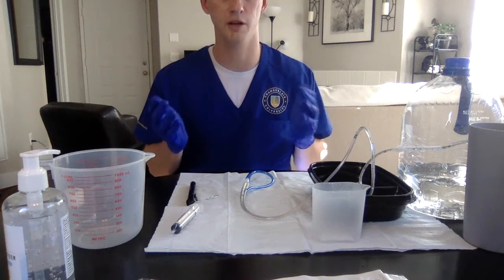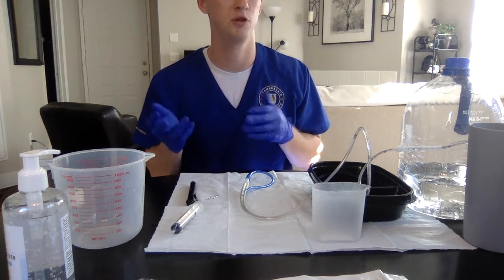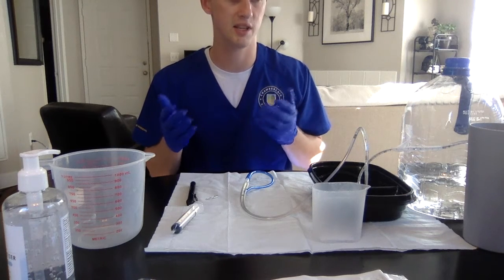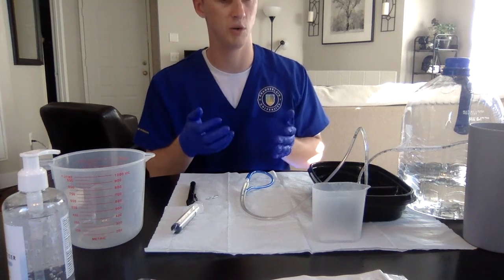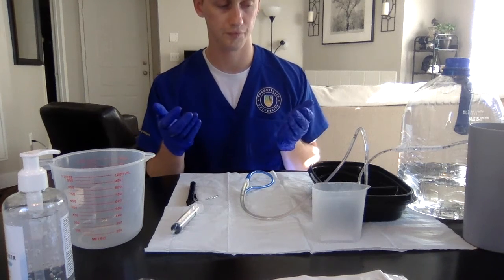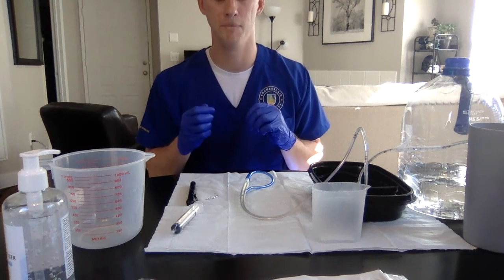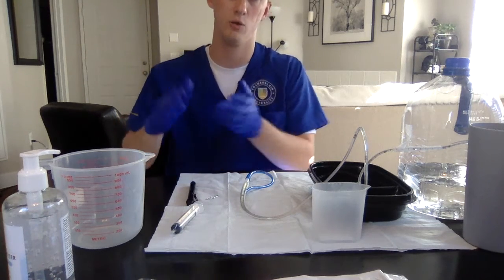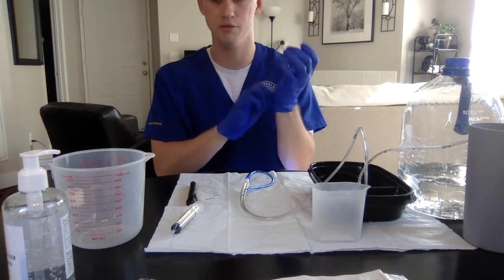So then we'll say a few days later, the doctor asked for us to remove the NG tube. We would enter the patient's room, introduce ourselves, ask for the 2 patient identifiers, so ask for their name and date of birth, assess if they have any allergies or if they are in any pain today. We're going to explain that we're going to be removing the NG tube from their nose today, and ask if they have any questions and if we can proceed with the procedure. So once we do that, we are going to perform our hand hygiene. We can also take lung sounds and bowel sounds and don a new pair of clean gloves.